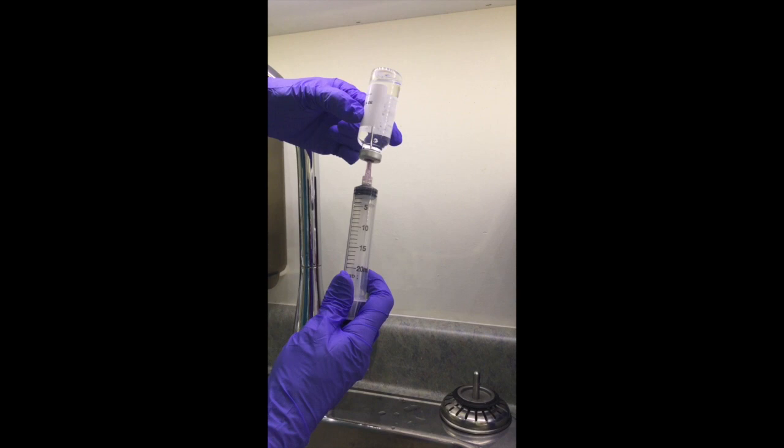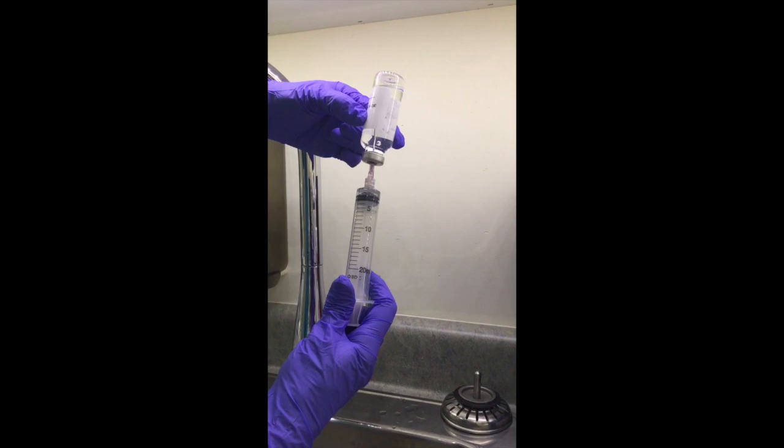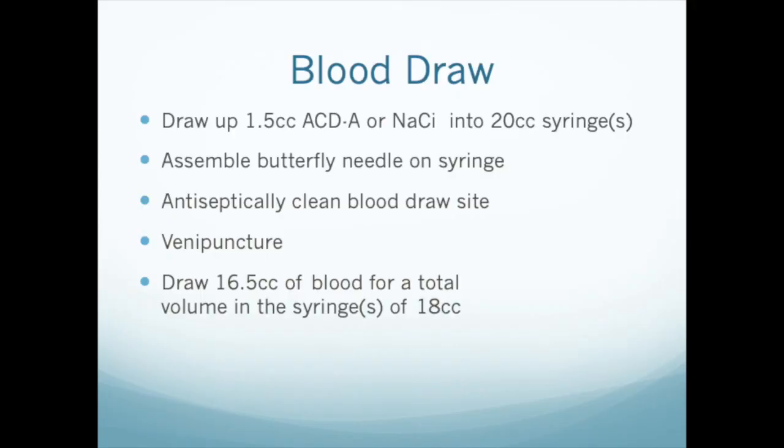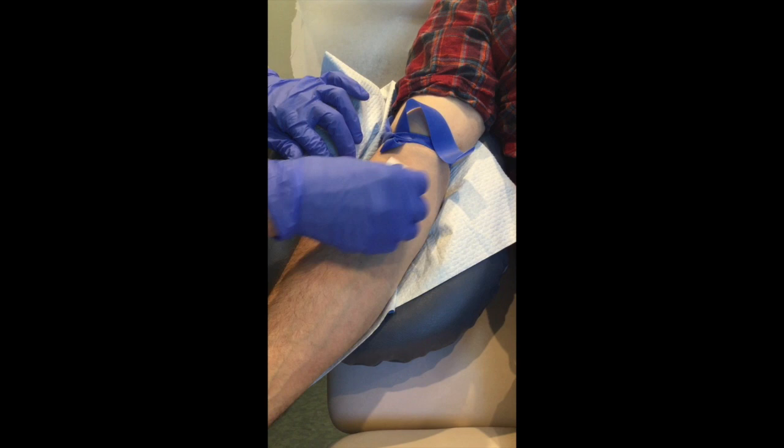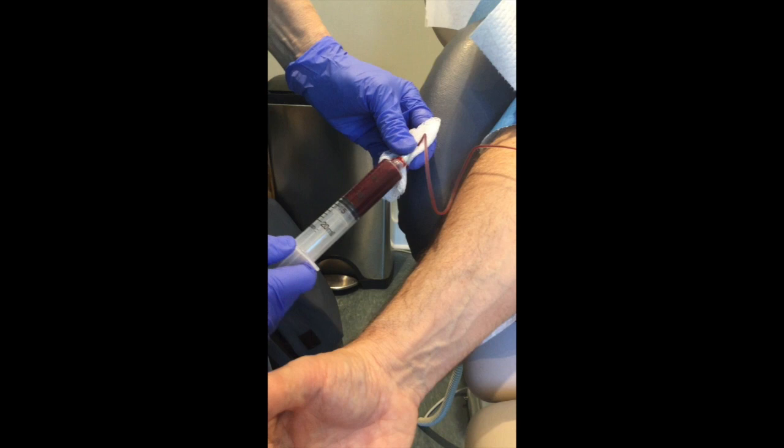Before venipuncture, draw up 1.5 mils of ACDA or sodium citrate into a sterile 20 mil syringe. Then attach your blood draw needle, apply the tourniquet, prep the patient, and proceed with venipuncture. Fill the syringe with 16.5 mils of blood so that the total volume is 18 mils.